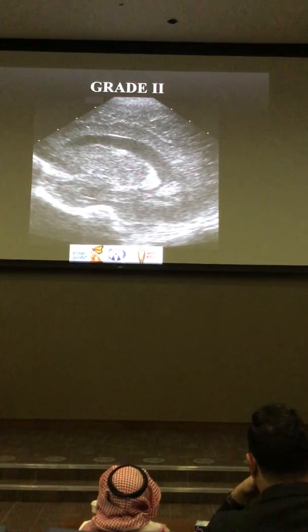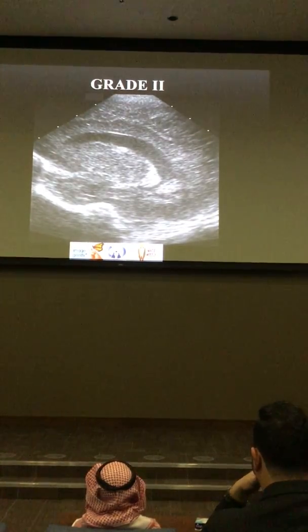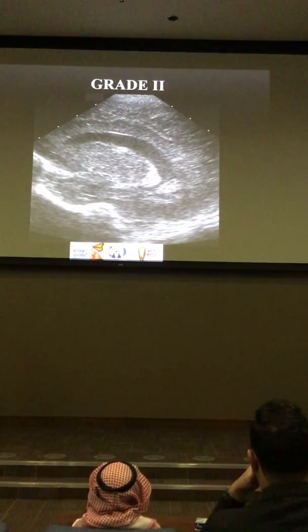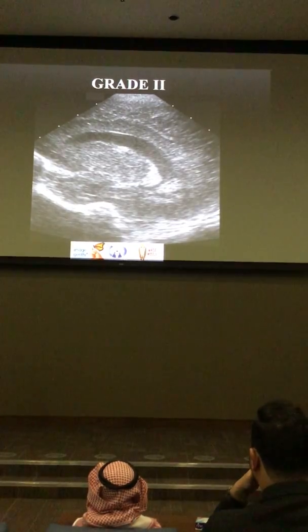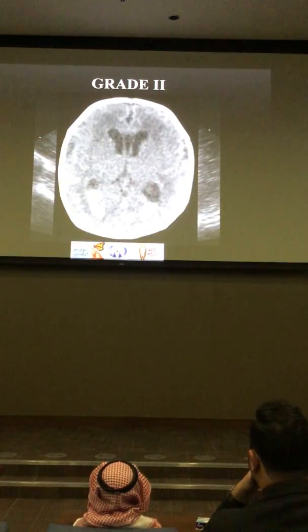The problem is when you have irregularity of the choroid plexus, or lobulation, or asymmetric lobulation of the choroid plexus. Sometimes bleeding is just coating the choroid plexus, so it is really challenging. The best way to resolve this kind of ambiguous situation is by follow-up, to see how this is propagating. So grade 2, to make it simple for you, is intraventricular hemorrhage without dilatation.